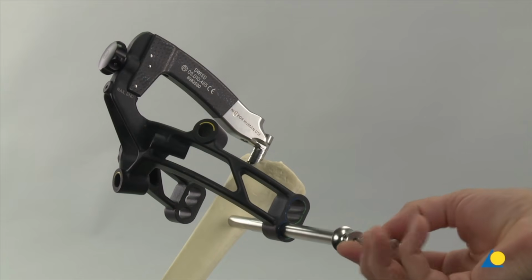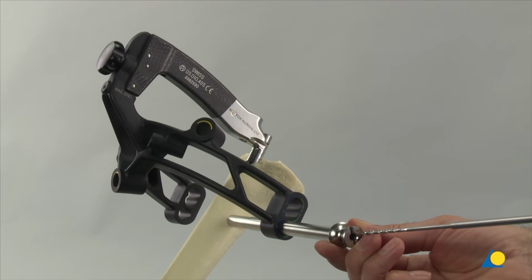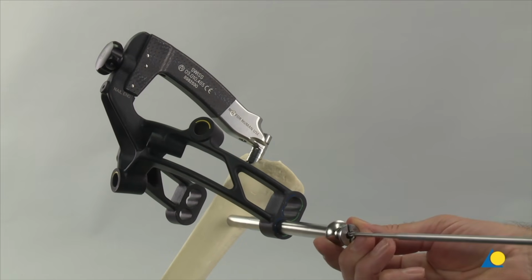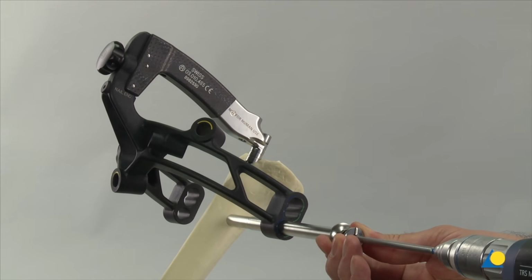The trocar is removed. While ensuring that the drill sleeve is pressed firmly to the near cortex, a 3.2 mm hole is drilled through both cortices until the drill bit just penetrates the far cortex.